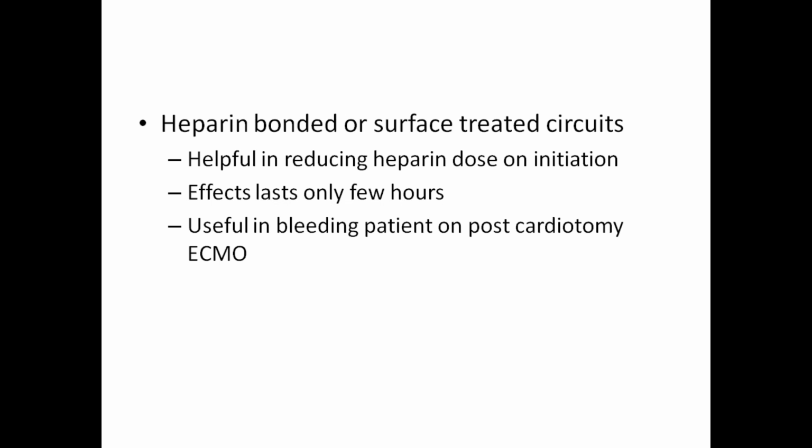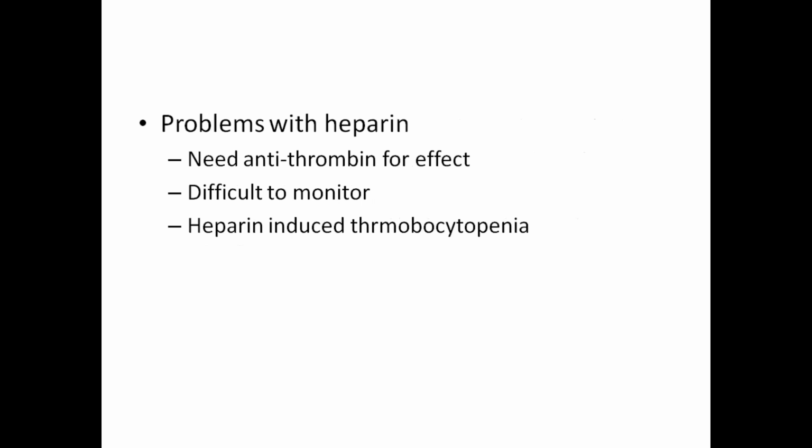So to decrease the heparin issues, some people came up with the idea of a heparin-bonded circuit, as Sunil mentioned. If you have a heparin-bonded circuit, then the heparin requirement comes down, especially if the patient has bleeding after surgery. But the effect usually lasts for a few hours. Sometimes, as Sunil said, there are instances where we run the circuit without heparin for a few days as well. The heparin gets released slowly into the circulation, so the heparin requirements are less.